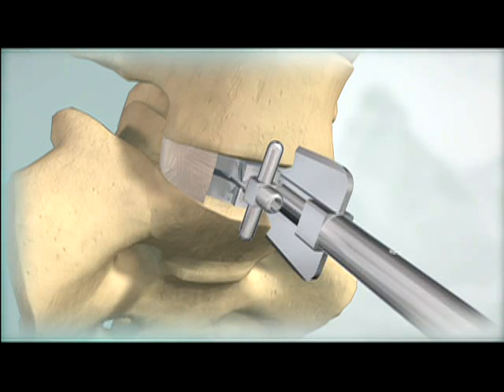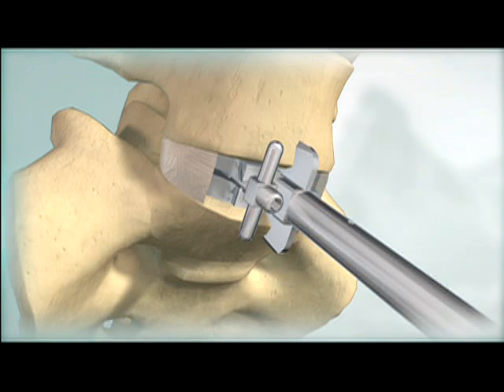Advance the chisel into the vertebral bodies until it is fully seated on the trial. The chisel and trial are left in place until the ProDisc-L Implant is ready for insertion.